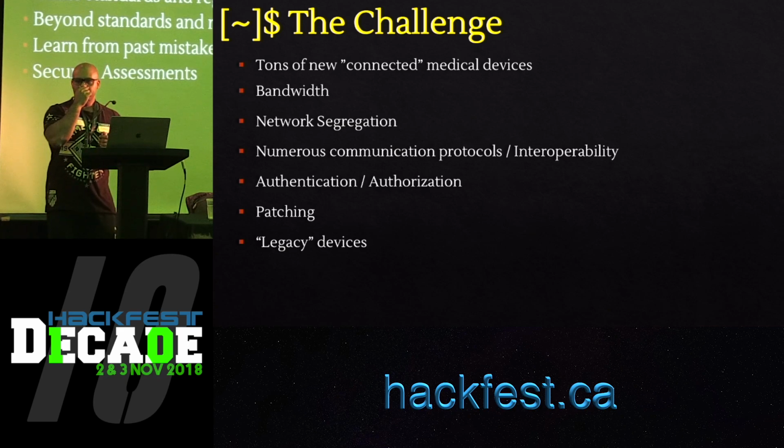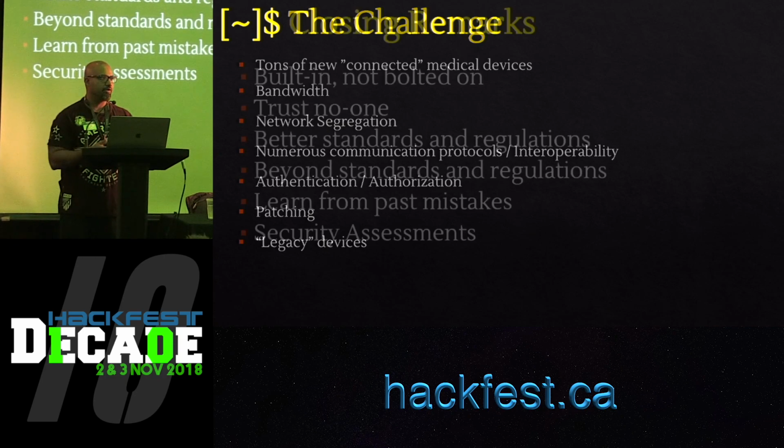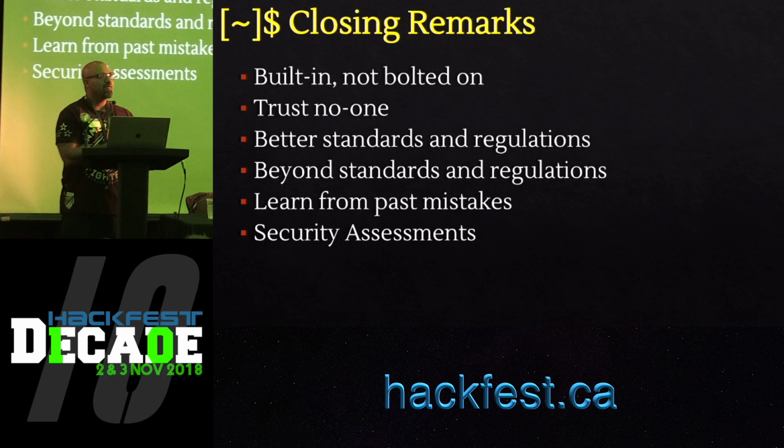As a closing remark, these are pretty generic. I would say that because there's a lot of race in getting these devices out, the security is bolted on rather than built into the devices. So the devices come out, and then someone posts a vulnerability disclosure for a certain medical device, and then they try to implement security on top of it, which has never actually worked.